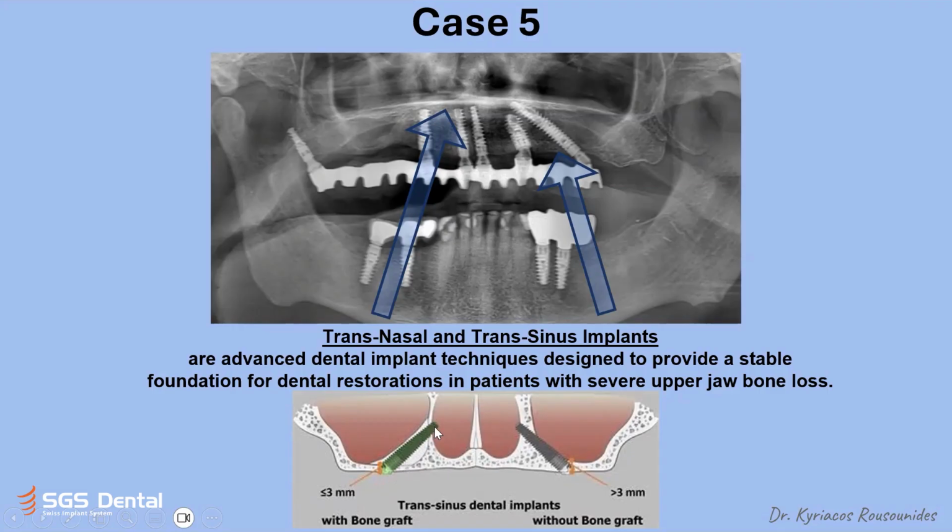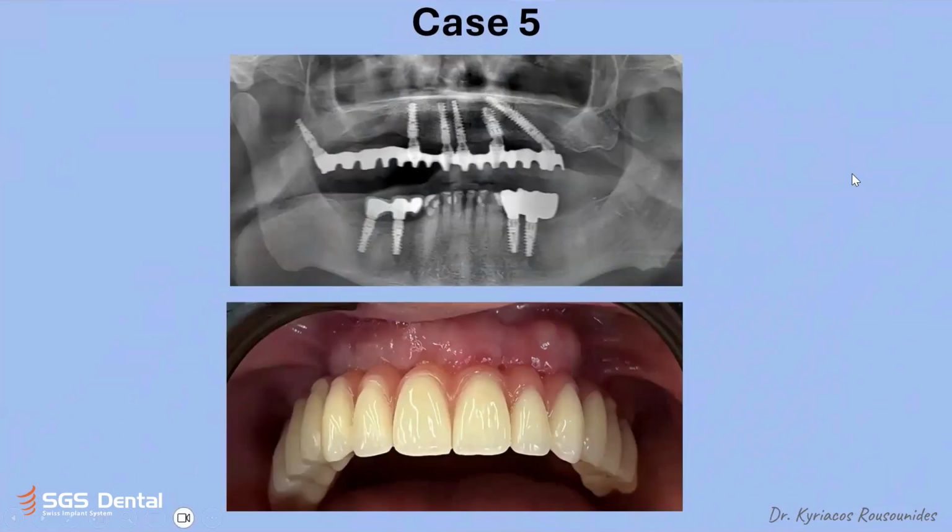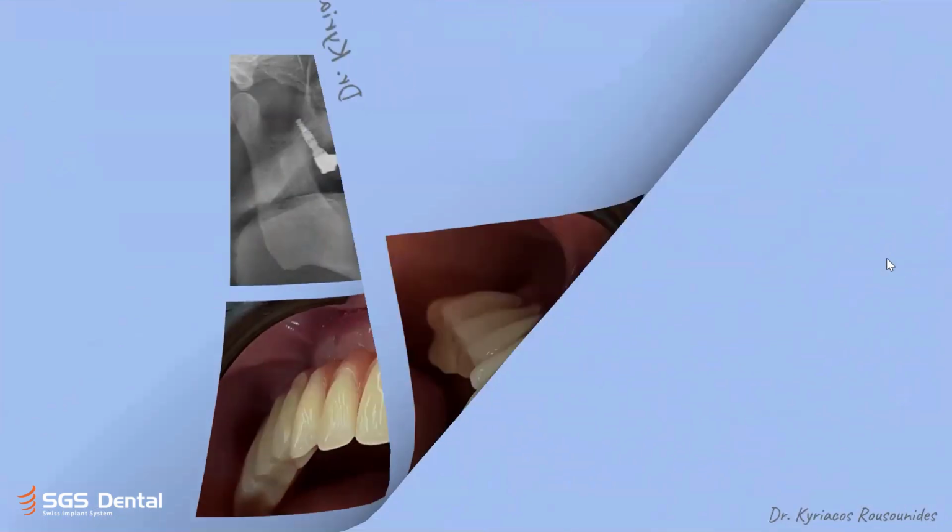That means this implant is stable. The other part is just to fill the area. It's not for stabilizing the implant. And the same here, 1 position and another 1 position, and maybe sometimes we have another anchorage here, and we reach very high torque and very stable implants with this method, as you can see here. And this is the final restoration of the above case.